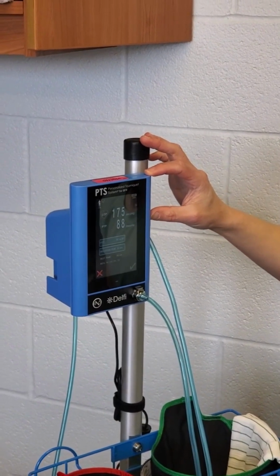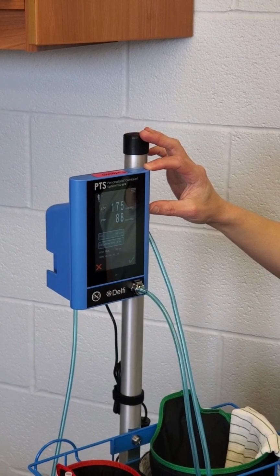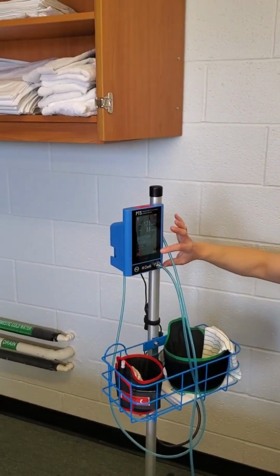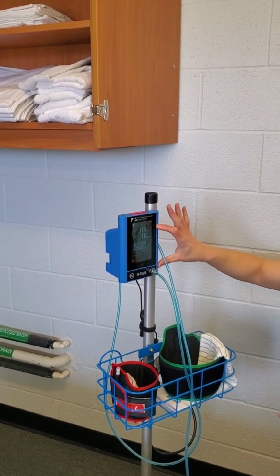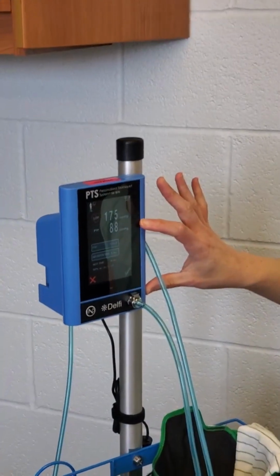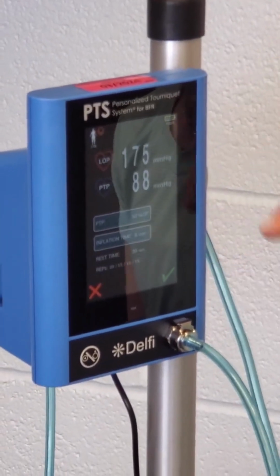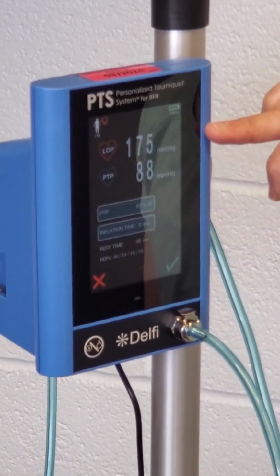Is her rate normal? It doesn't say her blood pressure on here. No, it isn't. It's kind of similar to a blood pressure cuff, but we're just calculating her total limb occlusion pressure and her personal tourniquet pressure at 50% limb occlusion pressure. Is that good? Those numbers are 50% of this. Is that where you start?